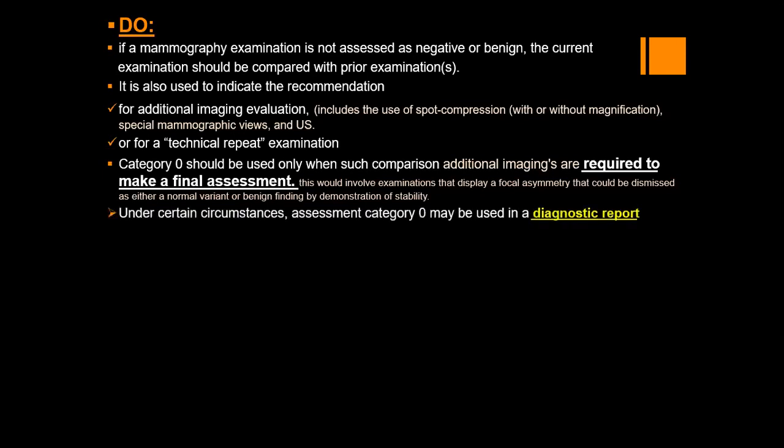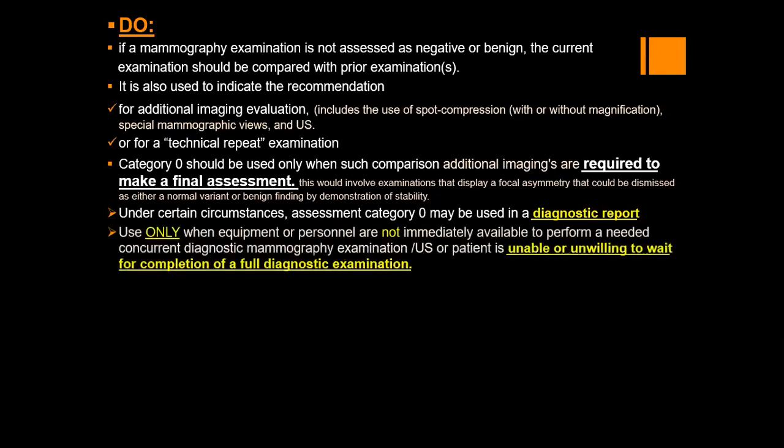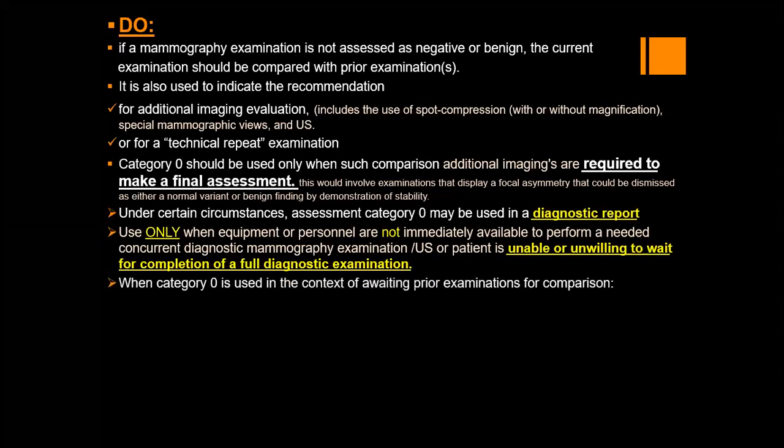Okay, under certain circumstances, we said we can use it in a diagnostic setting, like if the equipment or the personnel are not available at the time of performing the study, or the technologist is not available to do additional mammographic views or an ultrasound, or the patient herself is unable or unwilling to wait for completion of her full diagnostic examination, then we allow use of BIRADS 0 in the diagnostic report.